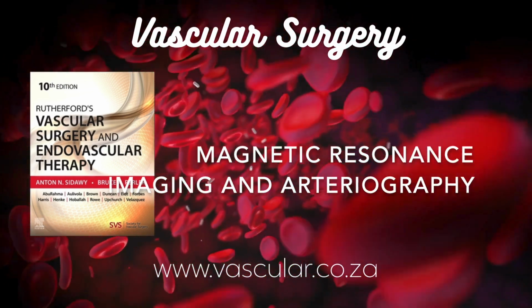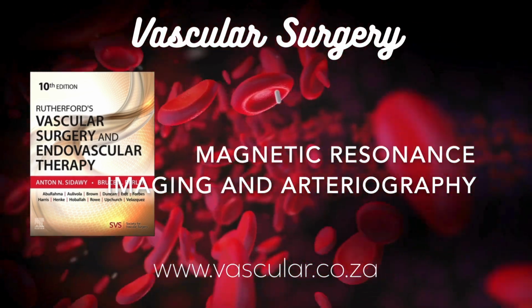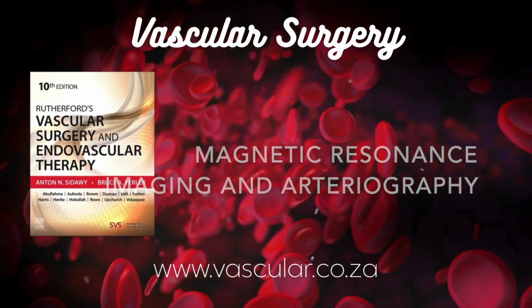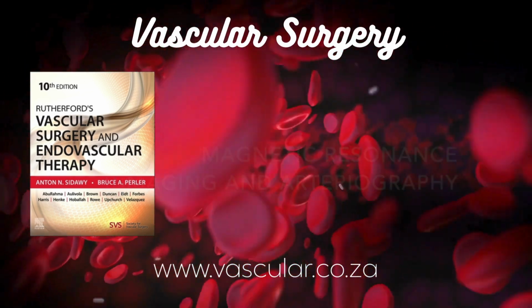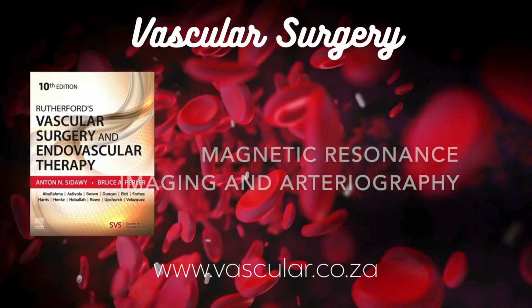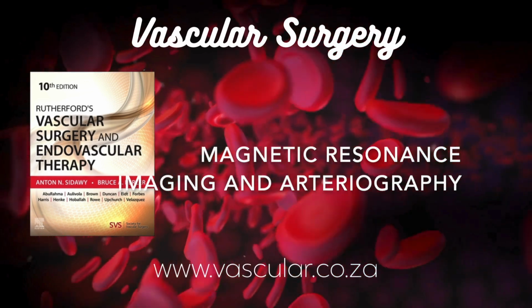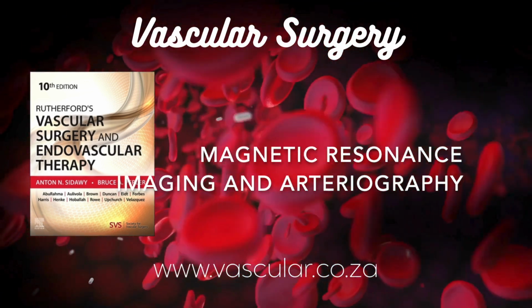Okay, now the gut, mesenteric vascular disease. Yep. Affecting blood supply to the intestines. Right. MRA is often used when doctors suspect chronic mesenteric ischemia, sometimes called intestinal angina, usually caused by narrowing of the gut arteries. It's pretty accurate for disease in the main superior mesenteric artery. Any other mesenteric uses? Yeah, it can help diagnose trickier things like median arcuate ligament syndrome, where a ligament squashes the celiac artery. MRA can sometimes show this compression happening dynamically by imaging during breathing expiration versus inspiration.